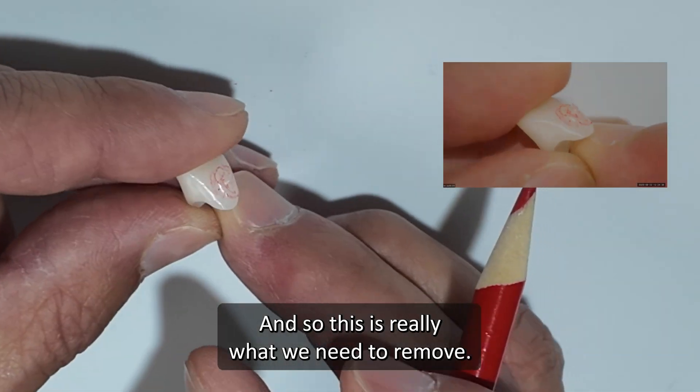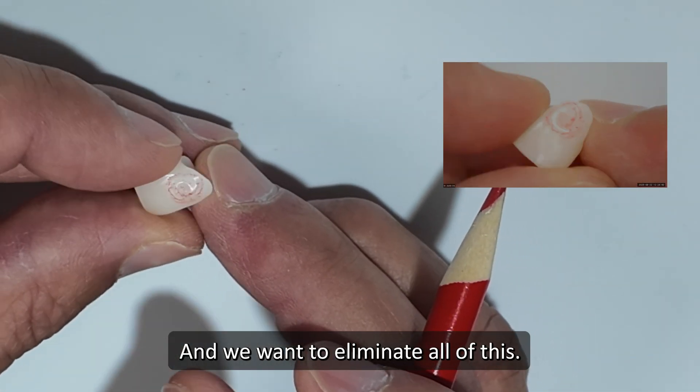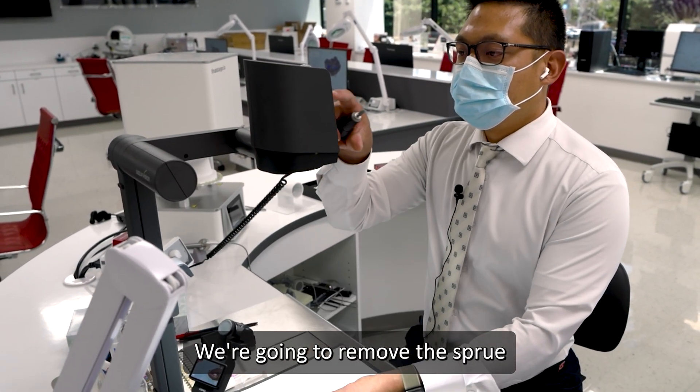This is really what we need to remove. We want to eliminate all of this. Using my lab handpiece, we're going to remove the sprue.